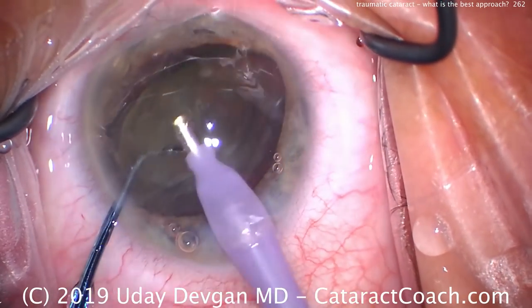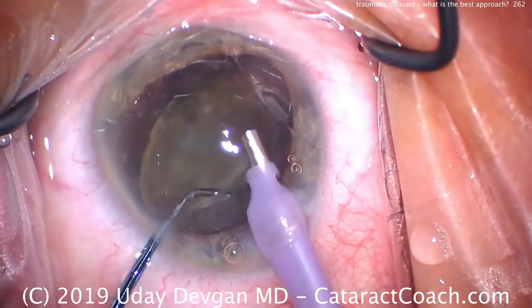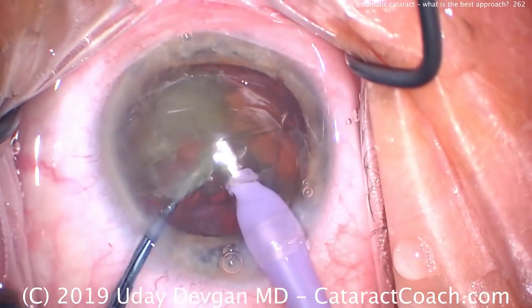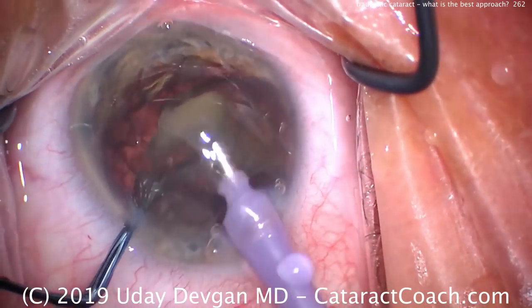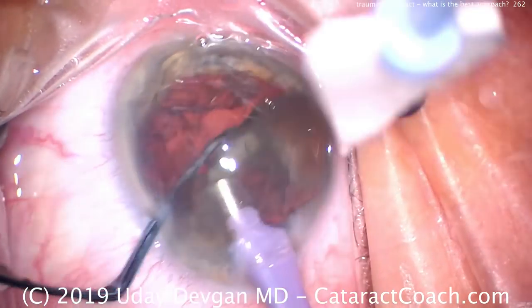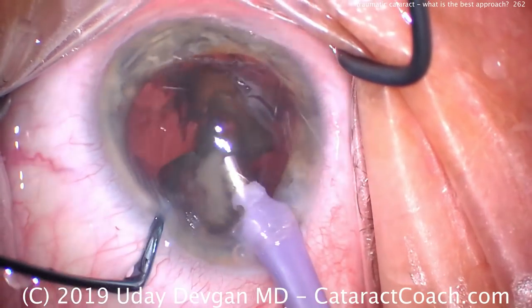So buzzing in the phaco probe into the nucleus. Not a lot of chopping going on here. It's just not a dense nucleus. We should be able to just emulsify it using the chopper to keep the whole nucleus in front of the probe and just keep occluding on it, keeping those pieces in front. Now, the wider, more opaque areas of the lens do have some density, do require some phaco energy. The rest of the lens is pretty soft.